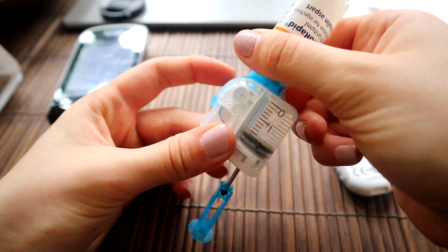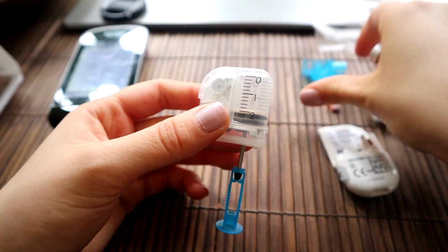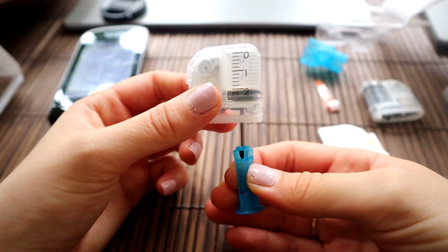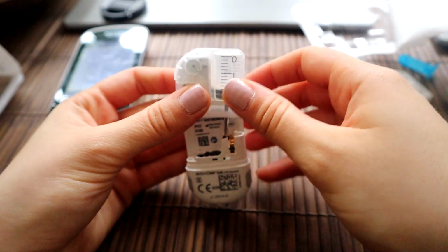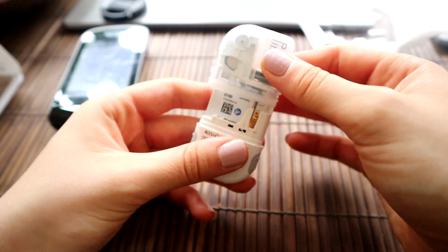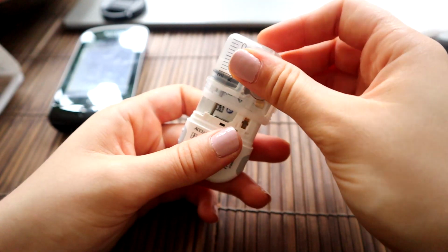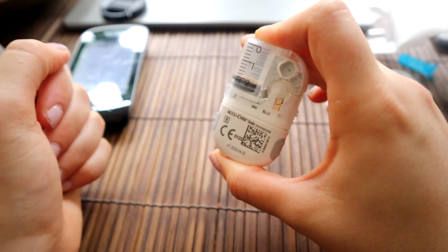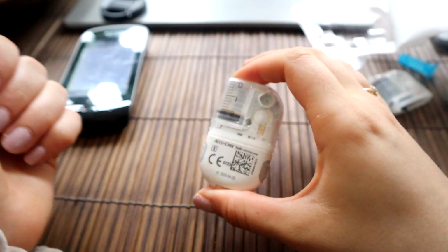So then you just take this whole blue bit off, and you can take this off of your insulin. Then squeeze these two blue bits together to take the plunger off of that. And then you literally just put it into the pump. So, it would help if I did it the right way around. And click, and there we go, it's connected.